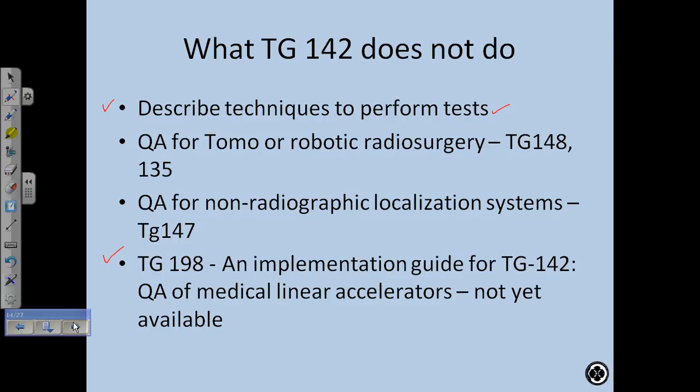Well, your manufacturer of the linear accelerator has typically, I don't know about Elekta, but for Varian, they have a pretty detailed customer acceptance procedure of all of these systems, okay? That's what I use, because that's another way of comparing it to baseline. Your baseline is the results you get during acceptance testing.